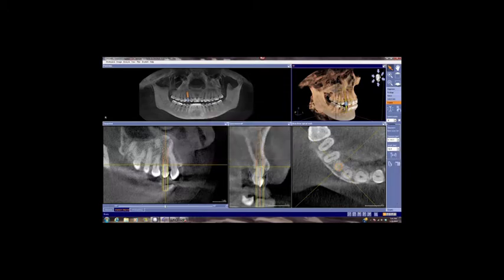Also, you can see here, if you change this to a 12 millimeter implant, then we're not going to be able to engage a whole lot of bone apically. So this is a 14 millimeter implant that was planned. Now, this case was done several years ago before the Straumann bone level tapered implants were available. At this stage, we do have the Straumann bone level tapered implants or any other tapered implant. So I would have planned this case for a tapered implant nowadays to give myself a little bit of room.